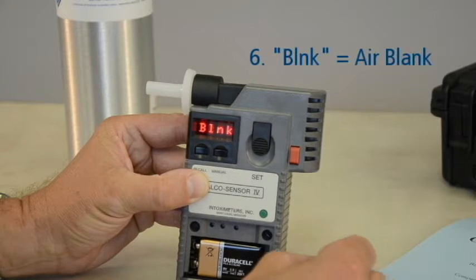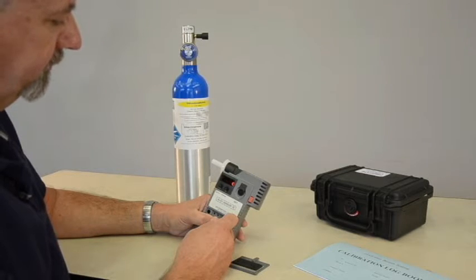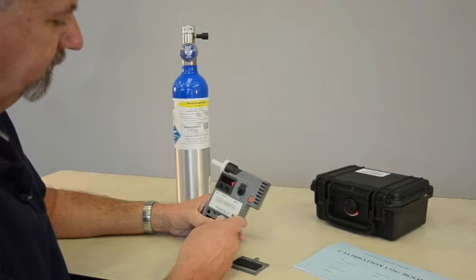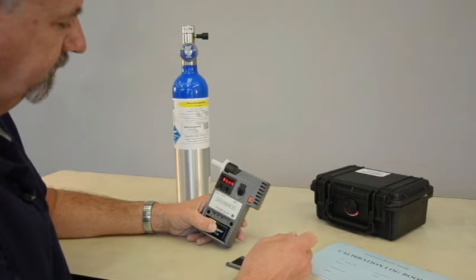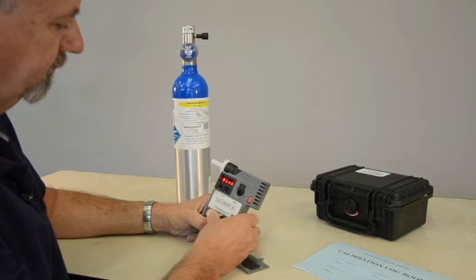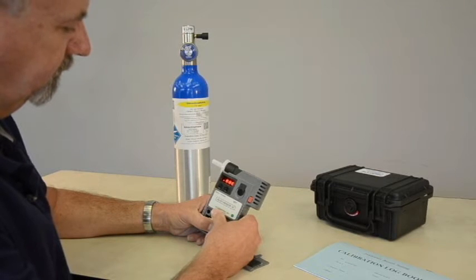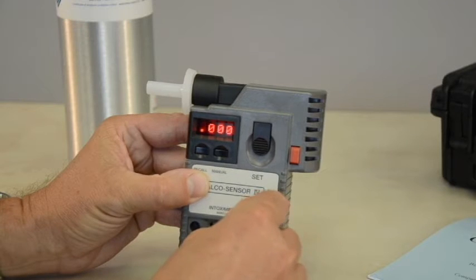the device will display BLNK. This means the instrument is performing an air blank on the device. An air blank is a procedure that checks the device for any residual alcohol that may remain from a previous test. If the instrument is free of alcohol, it will read 0.000 for a few seconds.